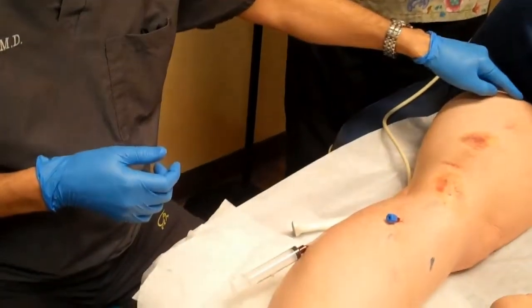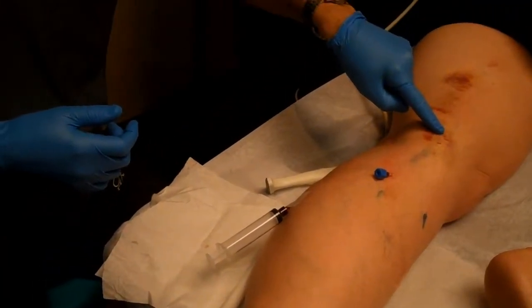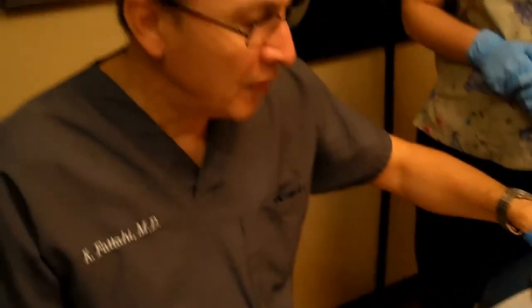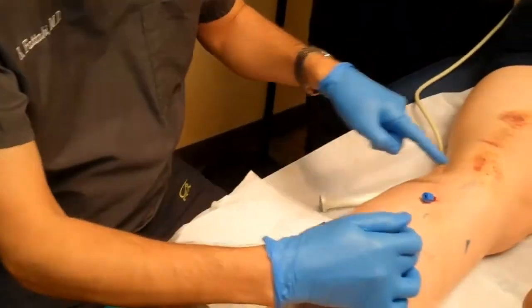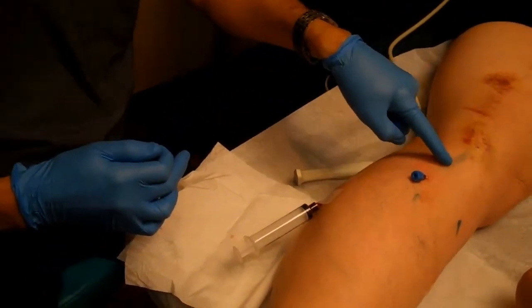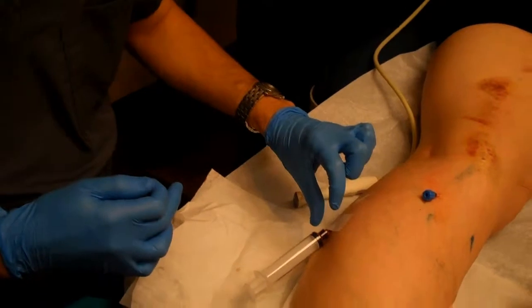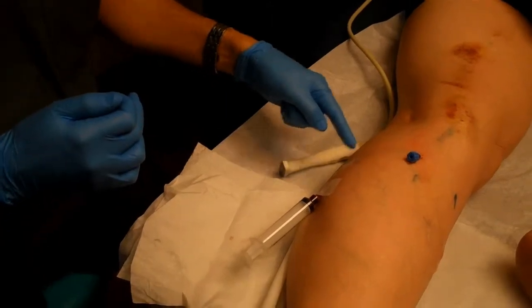This is another case of foam washout sclerotherapy. We have treated a very large caliber proximal great saphenous vein with endovenous laser ablation using a radial laser at 1470 nm, which was six to eight days ago. Now the distal part has very large branches, especially the accessory branch that travels posteriorly and merges with the short saphenous at mid-calf, creating a 12 millimeter varicosity that goes to the posterolateral left ankle. The proximal short saphenous is normal.